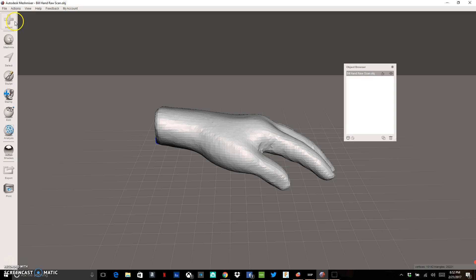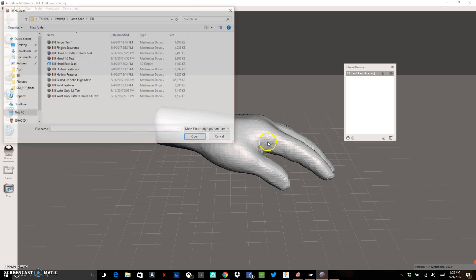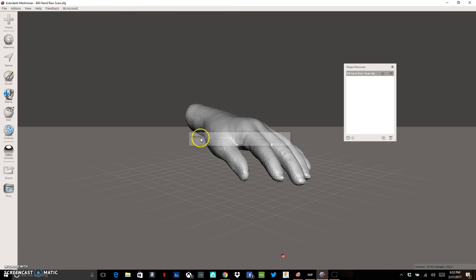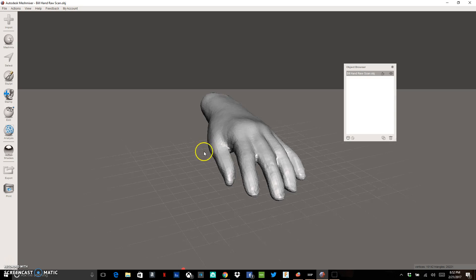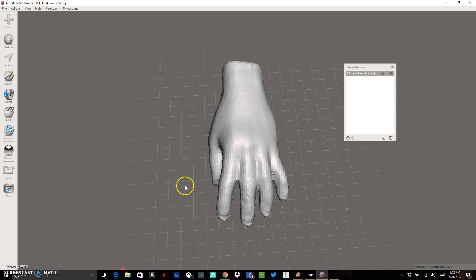The first thing we want to do is import our 3D scan. I'm going to go up to File, go down to Import and replace whatever is loaded into Meshmixer, and open up my raw scan. I can look at it and I can see there are going to be some things I need to adjust.